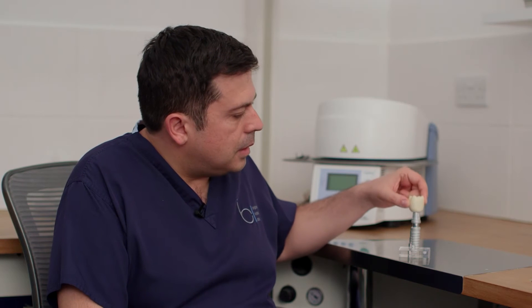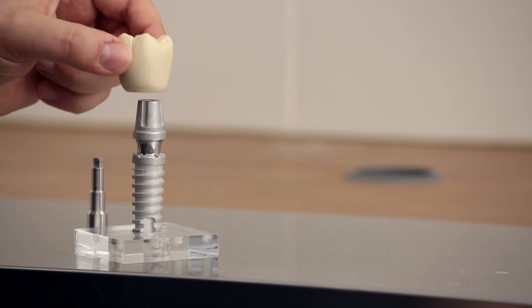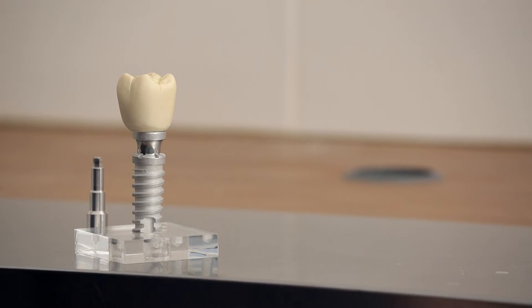Finally, the crown is then positioned onto the abutment. This crown can be made in a variety of materials as well. At the clinic, we offer three different options of different implant crowns.